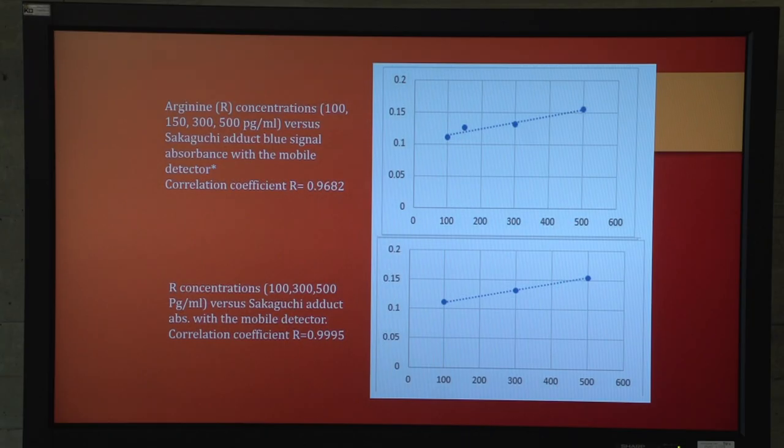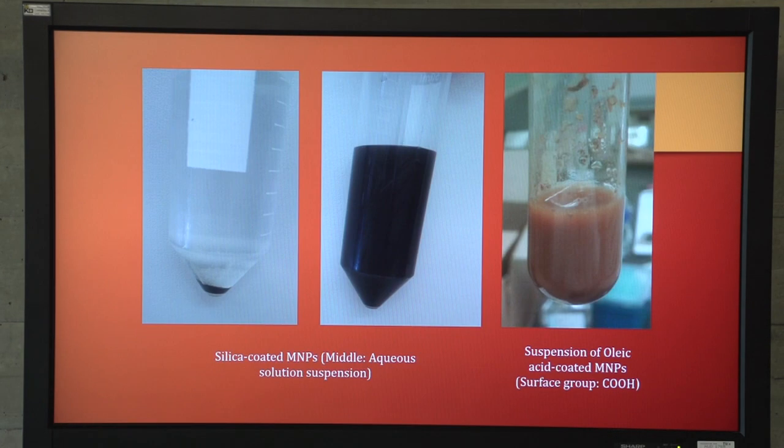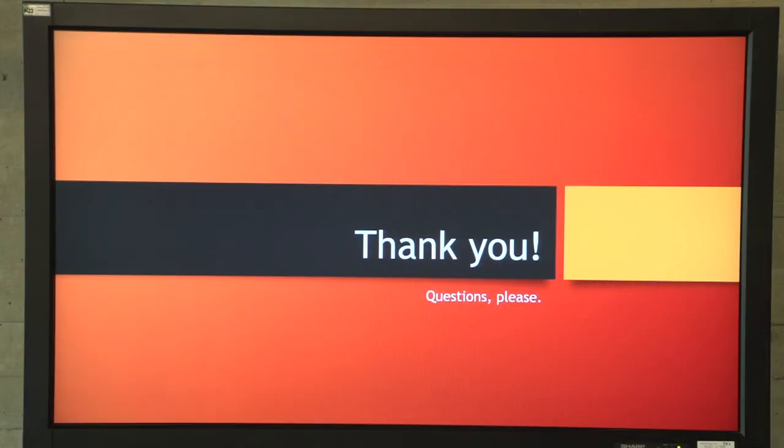And actually, we opted to separate the NT-proBNP using magnetic nanoparticles loaded with antibodies. But we couldn't do that in time because our antibodies got denatured from storing in the airport. So that's basically what we worked on. Feel free to ask any questions. Thank you.